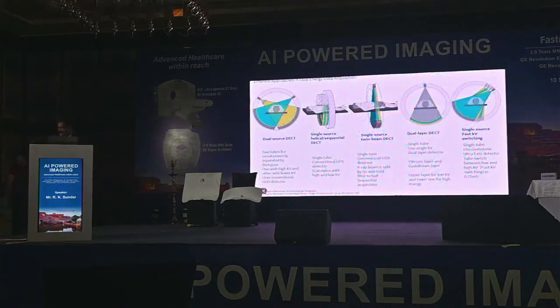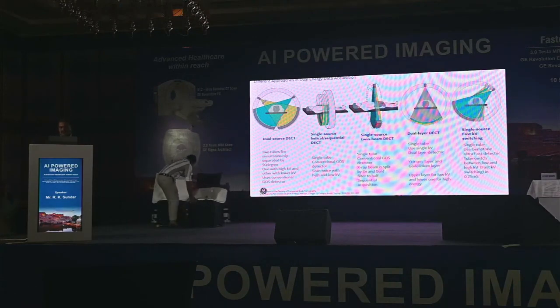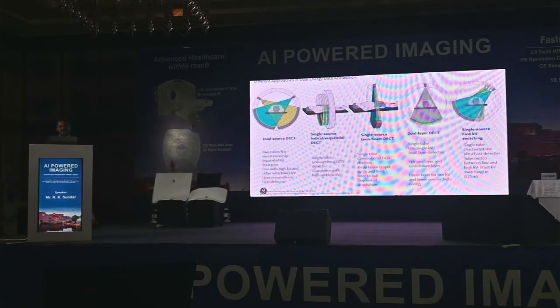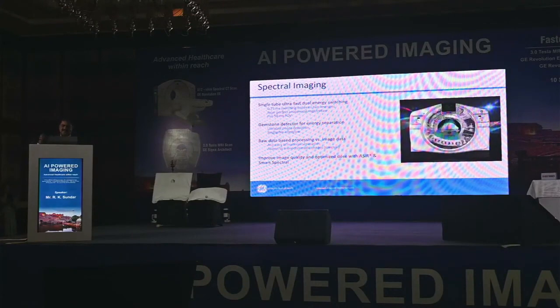There are multiple technologies in dual energy imaging, and spectral CT ranks the highest. This is also called fast kV gemstone spectral imaging. How is this done? You have an X-ray tube and the detector there. The detector, as I told earlier, is the gemstone detector, and the X-ray tube fires the X-ray very fast at 2 energies, 80 and 140 kVs.